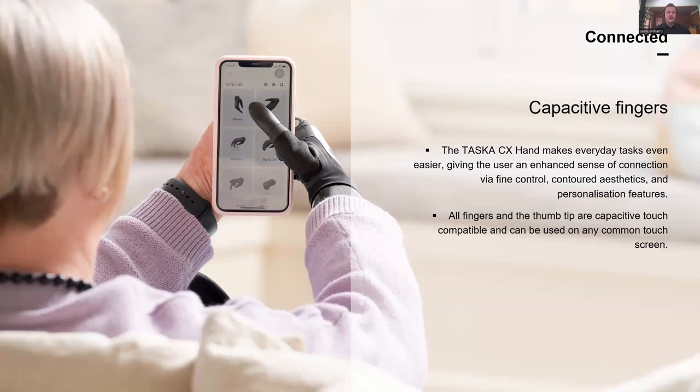Another major feature and advancement is capacitive touch. The CX hand is now touchscreen compatible. Instead of just a single point on the finger that's hard to access, it's the entire grip pad — that grip pad wraps around the full fingertip. And it's not just the index finger — it's all of the fingers and the thumb. When you're using a prosthesis you're not as dexterous as the sound side, so it might be easier to touch with your thumb or scroll with your pinky finger. That's the feedback we got from our field trials — people are loving that new feature.